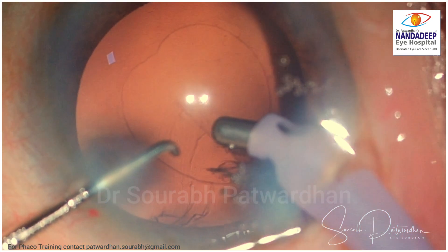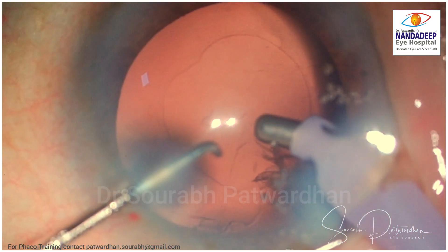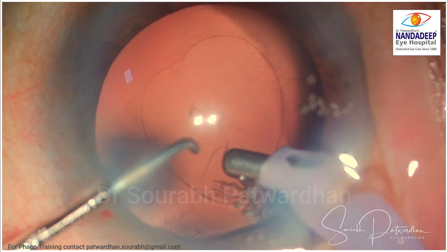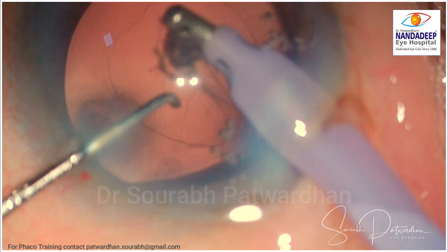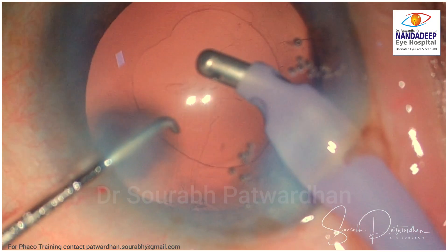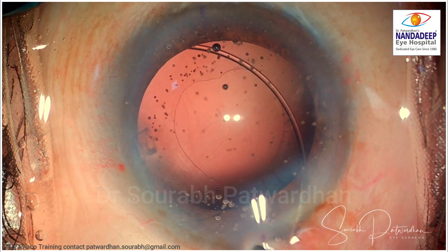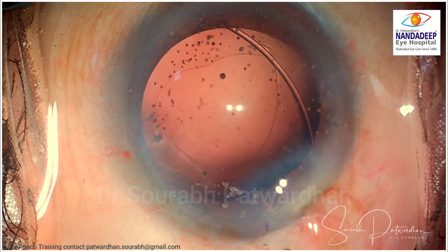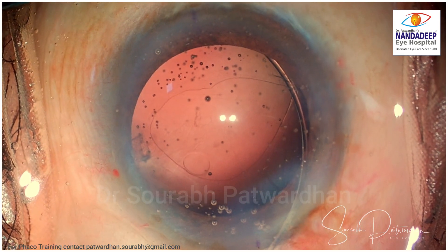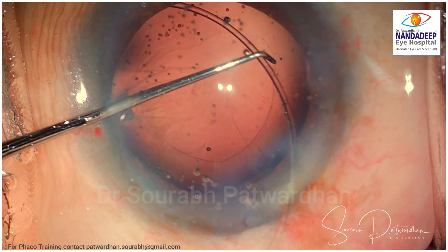What I am doing here is removing the cortex from the posterior capsule first so that even if I leave a little bit of cortex, it is only in the periphery and vision should not get affected. Again here I am going to put a CTR to support the bag so that I have good centration of the IOL in the post-operative period.